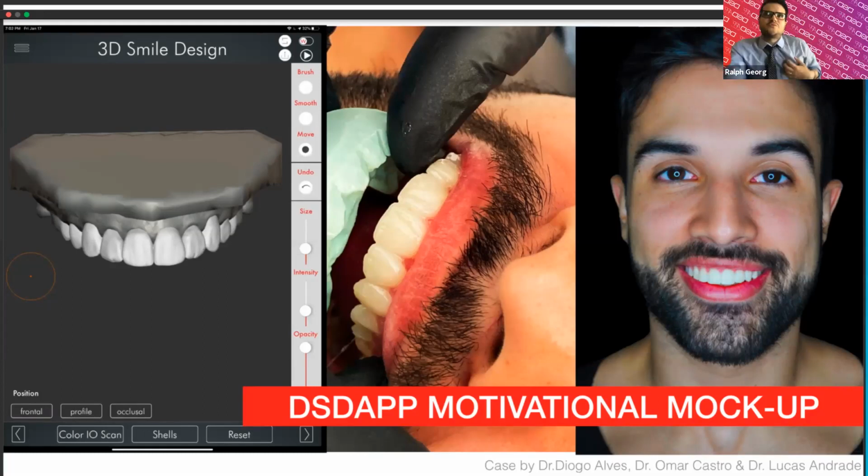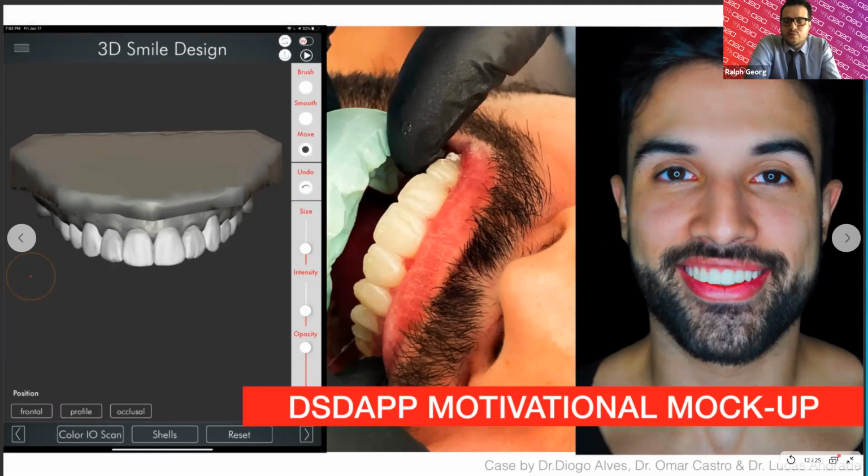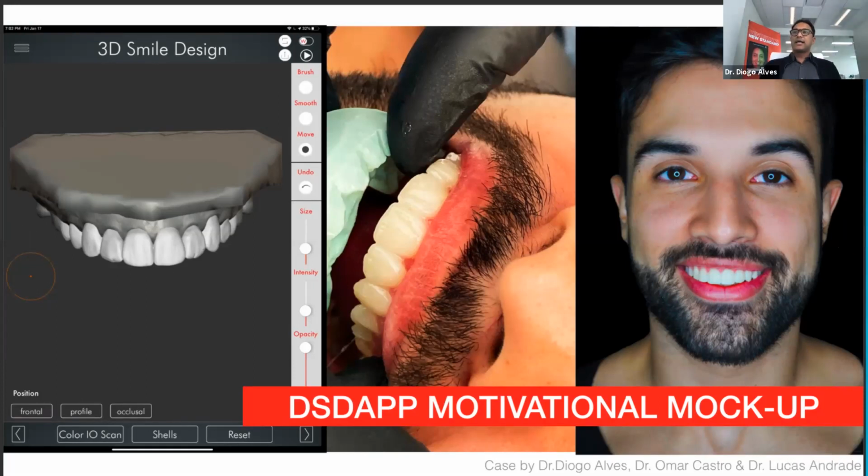And that's when you go to your patient and you say, Mr. Jones, how would you like to test drive your smile? And then they say, huh? How do I test drive my smile? Well, let me show you. And then you go into that motivational mock-up, and it's just a really great tool to use when you're trying to achieve that positive treatment acceptance. That's correct. And that's something that we also call the motivational mock-up.